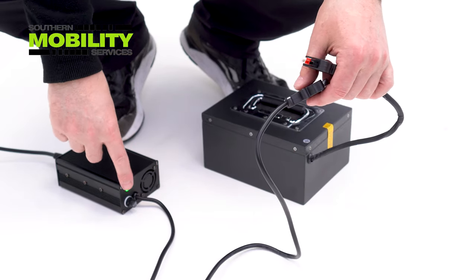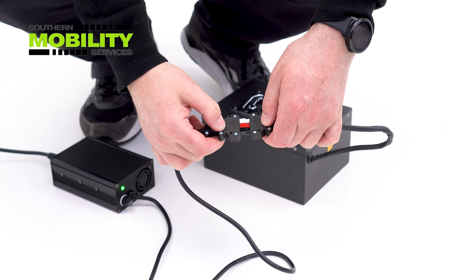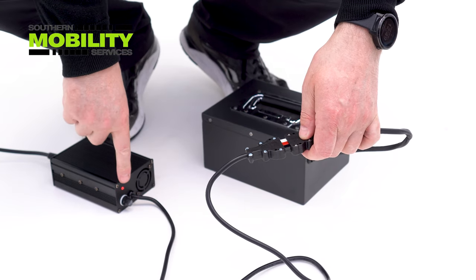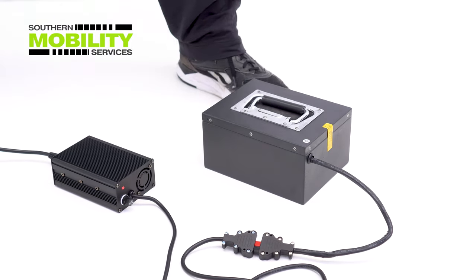Here we're showing you how to off-board charge the lithium battery. As you can see, the status light is green. When you connect the battery the light then goes red, and once fully charged it goes to green again and then you're ready for driving.